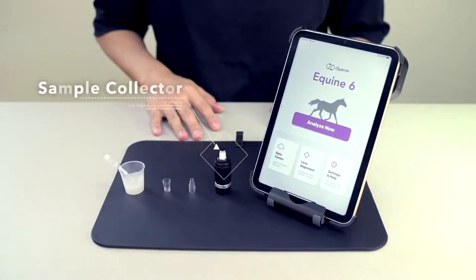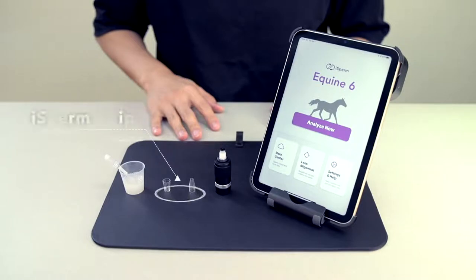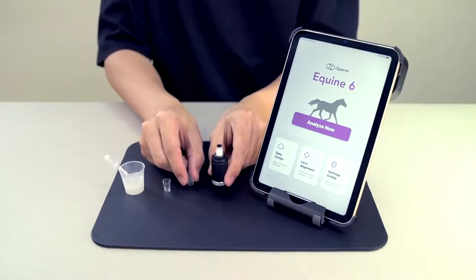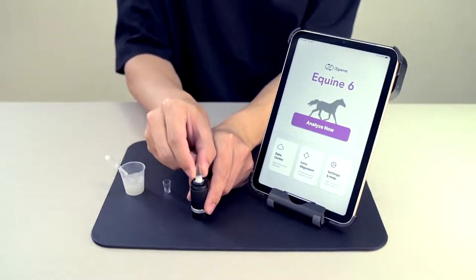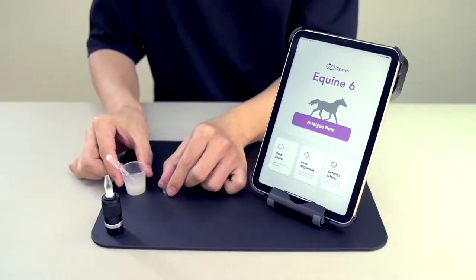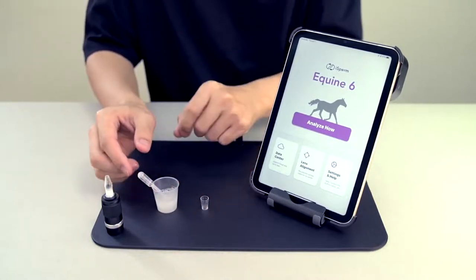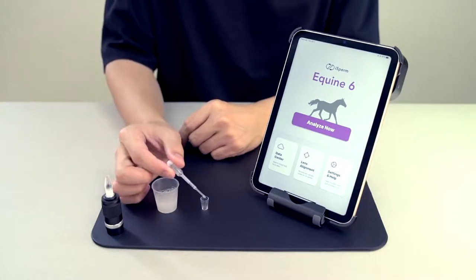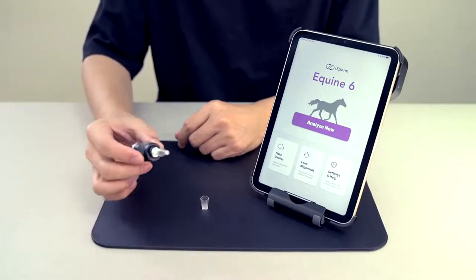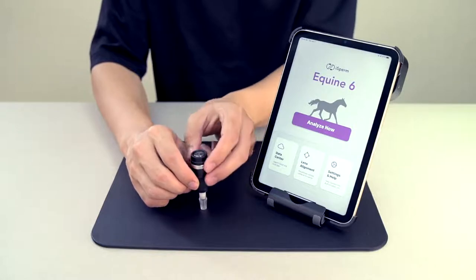This black stick is a sample collector, coming with a light source to help you work on sampling. These cups are called iSperm chips — they work with the sample collector. First, you need to install the base chip with the sample collector, then drop a pre-processed semen sample inside the cover chip, tuck the base inside the cover, and press it until you hear a click sound.